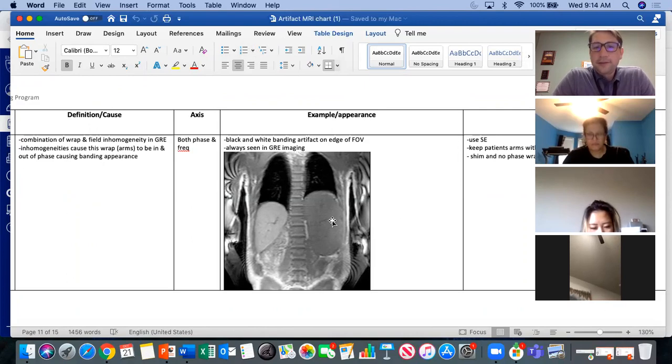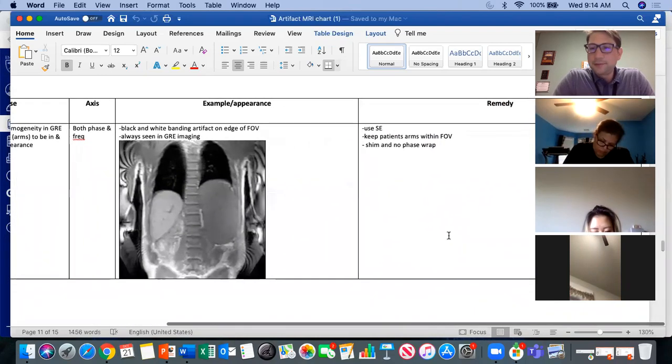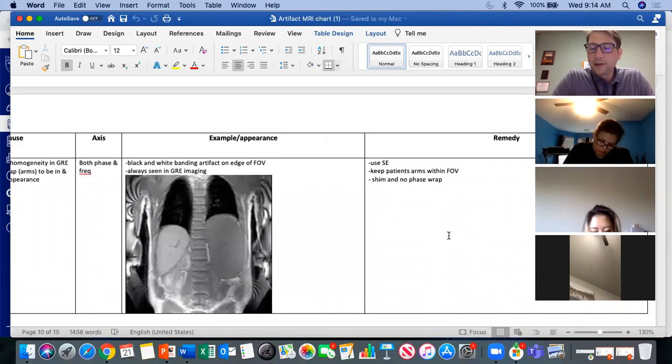All right. This patient, it looks like they have an enlarged spleen. I don't know if you guys see that already. This is just a localizing scan, but you can see that this is the liver. And on this side, it looks like there's another liver, but we know that there's no liver on the left side of the patient. So this is probably their spleen that's enlarged. So that could be causing a lot of issues. And see how it pushes up the diaphragm on the left side, which normally sits lower. Just to keep your eye on pathology.